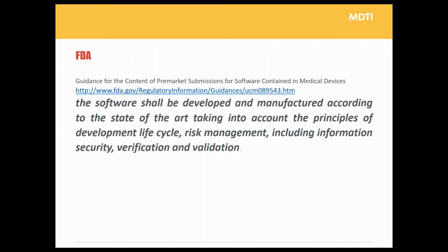Now, I'm a regulatory and quality consultant. I do a lot of training. I deal a lot with companies who are developing elements of software to either be included in or support the function of their medical devices or in vitro diagnostic products. And the problem I see is people don't read that statement. State of the art is very, very important, but the development life cycle is at the heart of what we need to hear.